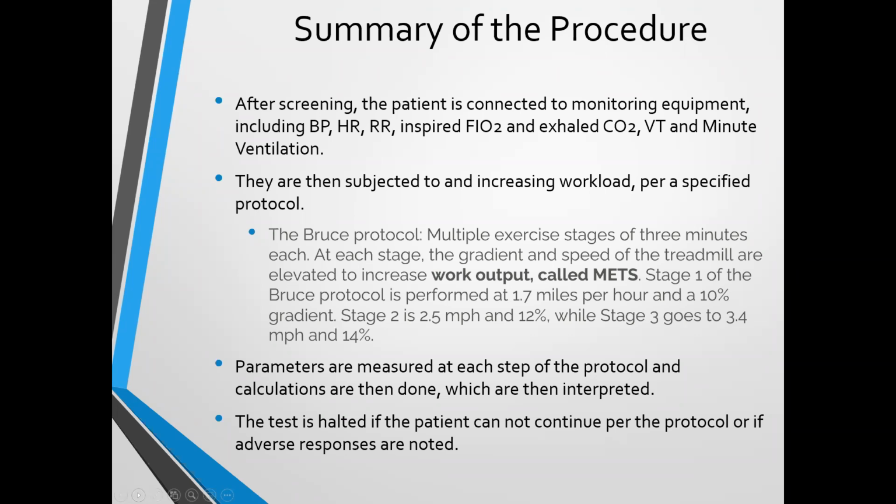And if we were to do cardiopulmonary stress testing on each one of us, it would be done in a consistent manner. Some of us, because of deconditioning, because of cardiac disease, because of pulmonary disease, whatever, would at some point either not be able to continue, or the readings that the equipment would get would suggest we're going into what's called anaerobic metabolism. And I will talk more about that, which is clinically significant. It's going to suggest at that point that's where the limitation is actually occurring.